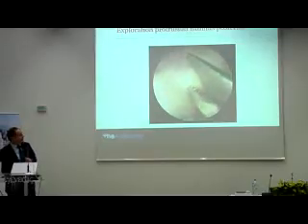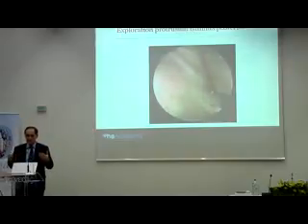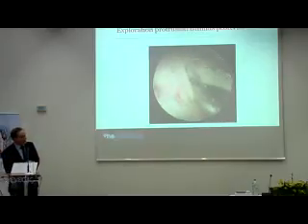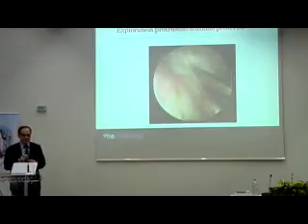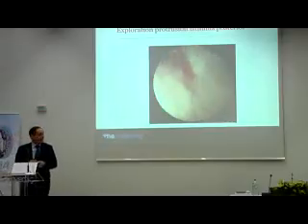Now here, the question is the same. Is this normal? What is behind the curtain? There is no cyst because we cut, it's solid tissue. Second question, if I cut, will it bleed? Because adenomyosis, neovascular, it bleeds, yes, thank you very much.